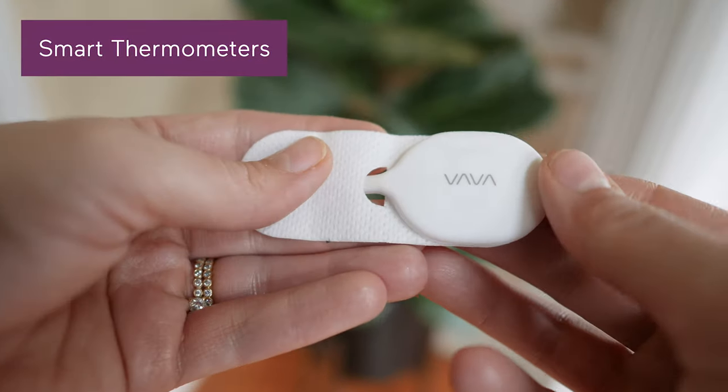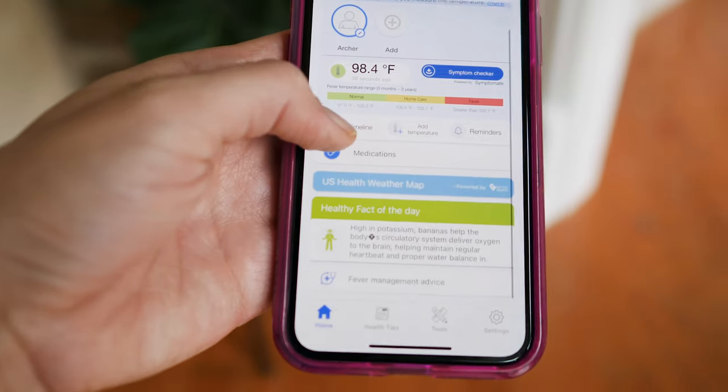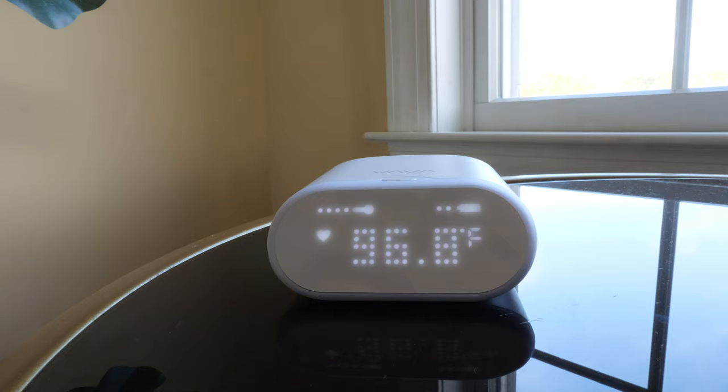Lastly, there's the smart thermometer. These are generally the most expensive options available, as they're often paired with an app that collects data to be analyzed or offer next-level measures to give you additional peace of mind.